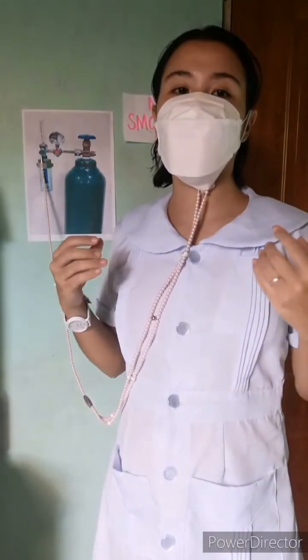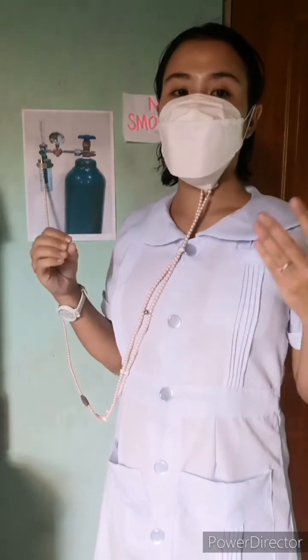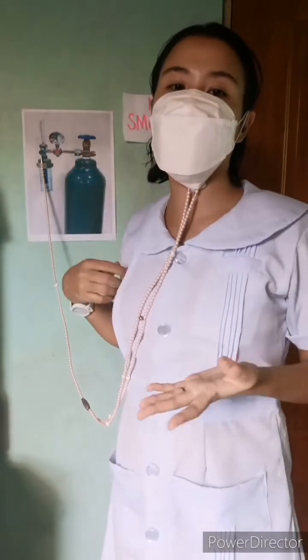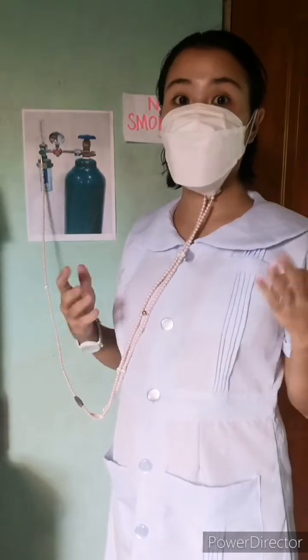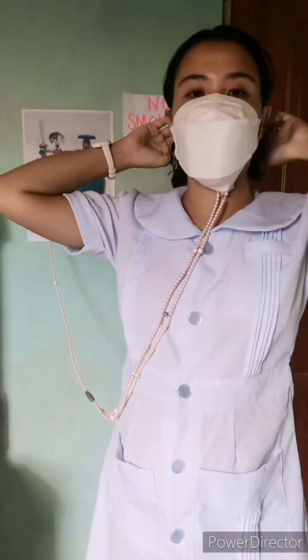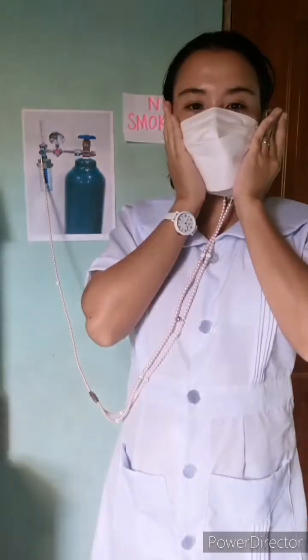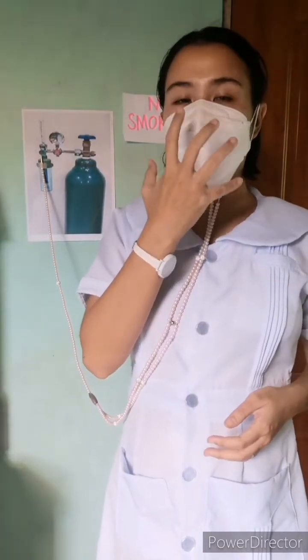Then the elastic band goes around the client's head to secure it so that the mask is more comfortable to use. Then pad the band behind the ears and over the bony prominence. The padding will prevent irritation from the mask. For a face tent, place the tent over the client's face and then secure the ties around the head like what I did earlier.